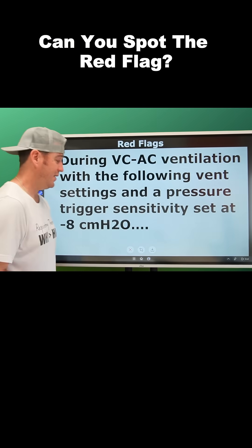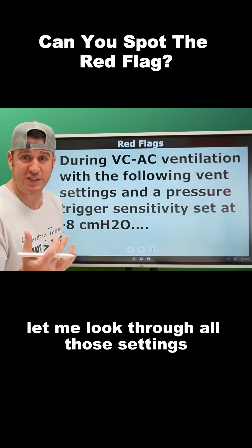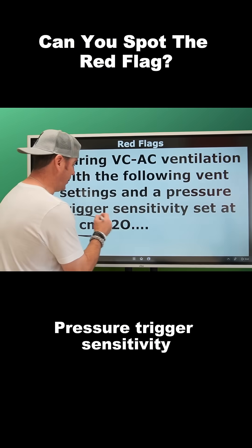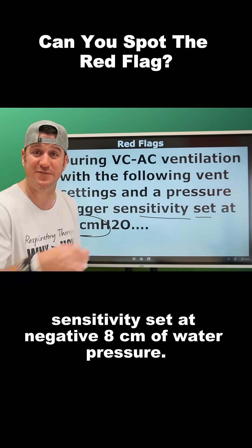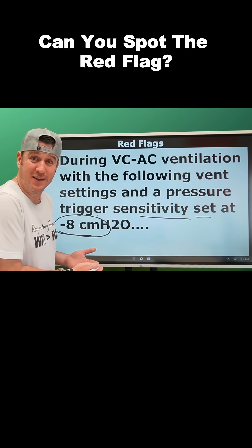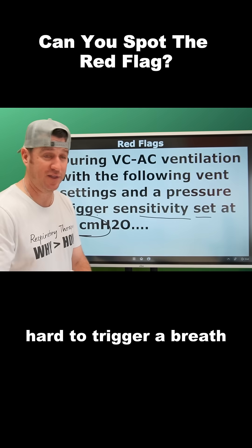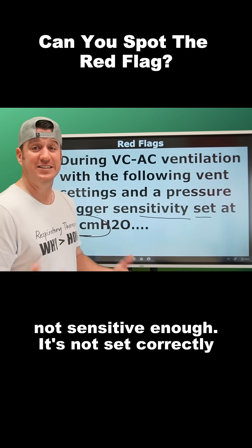Where's the red flag? If I'd given you all these settings, you could go, well, let me look through all those settings. And if all those settings look normal, no red flag — until you got here: pressure trigger sensitivity set at negative eight centimeters of water pressure. That's weird because that's too high. The patient on the ventilator is not going to be able to trigger a breath, or they're going to have to work excessively hard to trigger a breath because the sensitivity is not set sensitive enough.